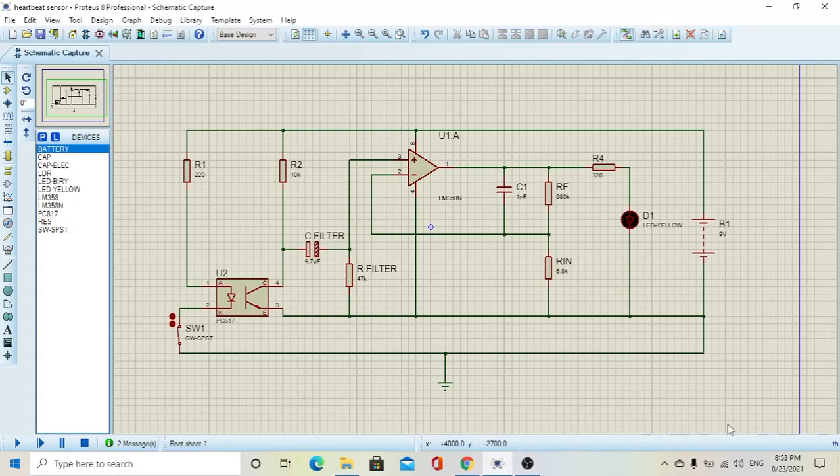In this video, we are going to test the heartbeat sensor circuit using an application called Proteus 8 Professional. This application allows us to simulate the circuit that we have connected and see if the circuit is working or not.